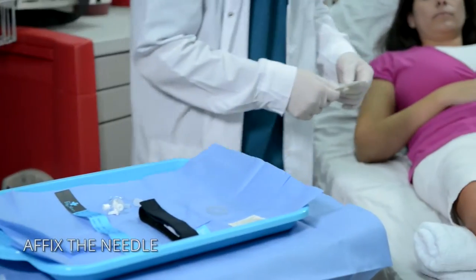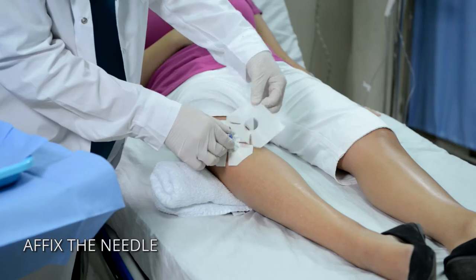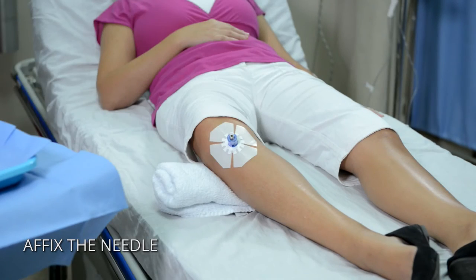After insertion, utilize the NEO fixation to immediately affix the needle stabilizer to the insertion site. Use the I.O. drill adapter when applicable.